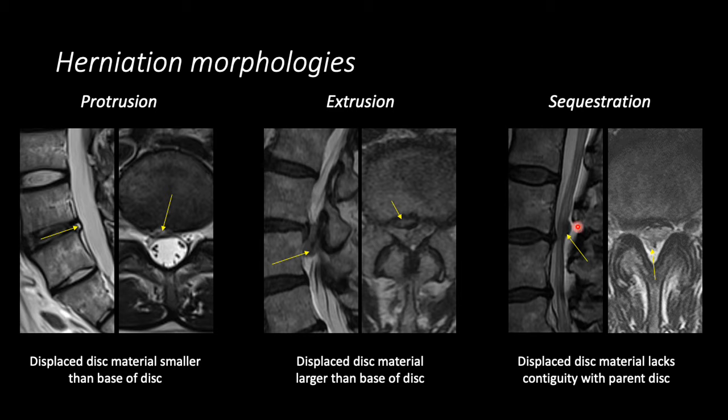This is another example of a subarticular zone disc extrusion. In this case, there is significant superior migration of disc material, and as we page down on the axial image, we can see this disc material within the lateral recess encroaching on the adjacent nerve roots. Here we have a disc extrusion located in the foraminal zone. On the sagittal T2-weighted image at the level of the pedicle, we see a bright ovoid T2-hyperintense structure within the foramen. We can see the nerve root displaced superiorly and compressed against the vertebral body, posterior margin, and pedicle. On the axial image, we can see this foraminal disc extrusion.